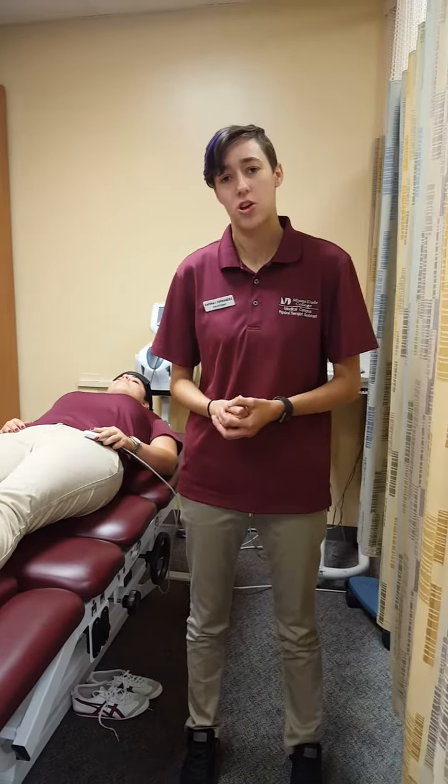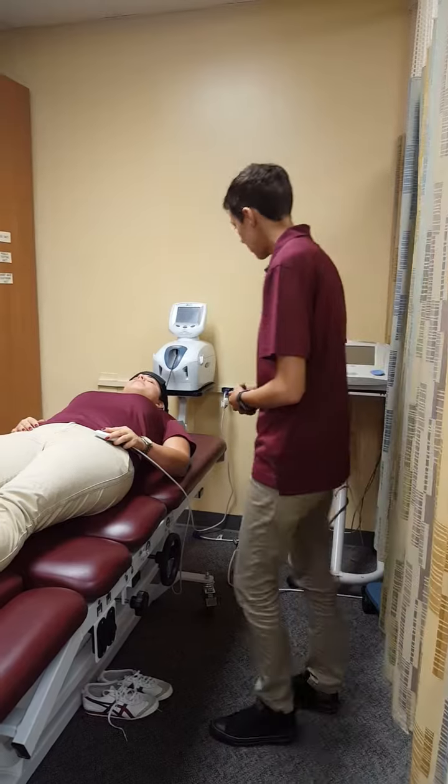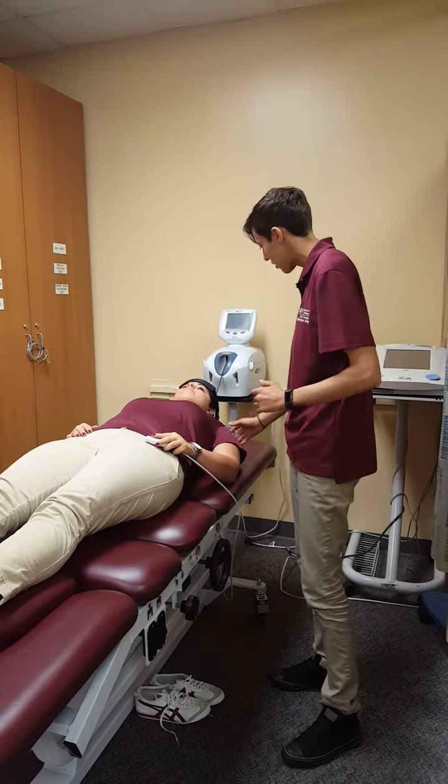So five minutes has passed. I'm going to check up on her. How are you feeling, UC? Good. Awesome. You just let me know if you need anything.